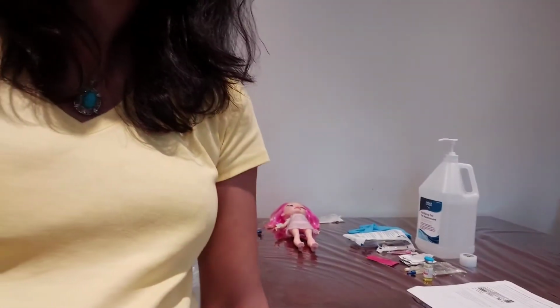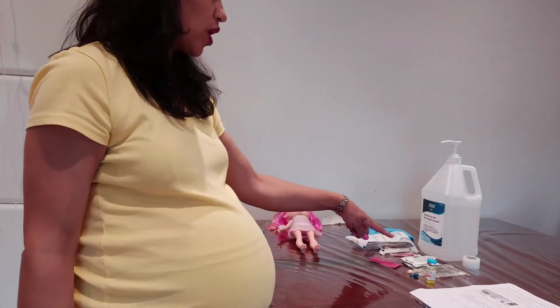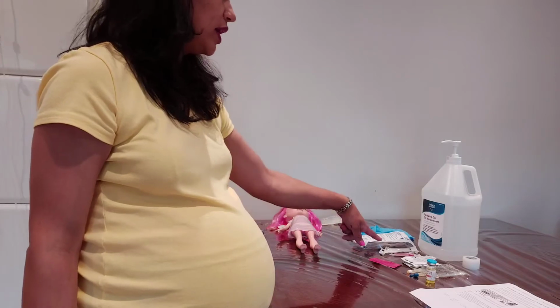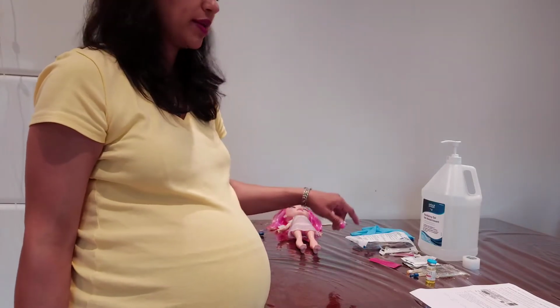Hi, today I'm going to administer IV medication by piggyback to a patient. First, I need to prepare the supplies. I put the camera here so you can see: a medication, mini bag, alcohol swab, label, syringe, needle, and secondary line.